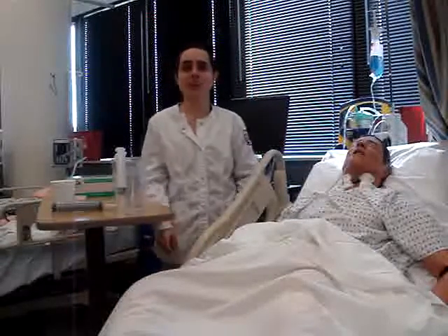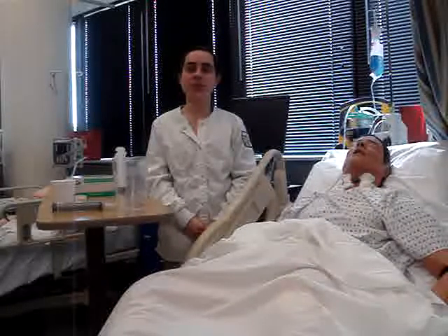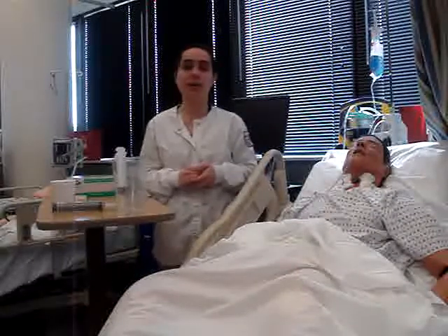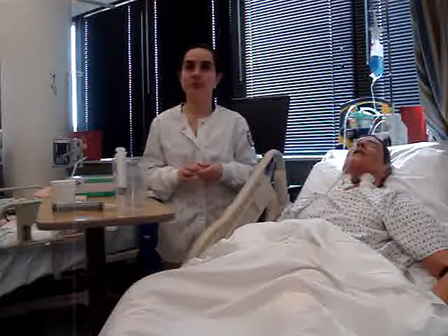I'm going to be administering a tube feeding today. What I want to do first is verify my medical orders. I want to check the type of the formula and the concentration I'm going to use, the volume, the route, the rate, and the frequency.